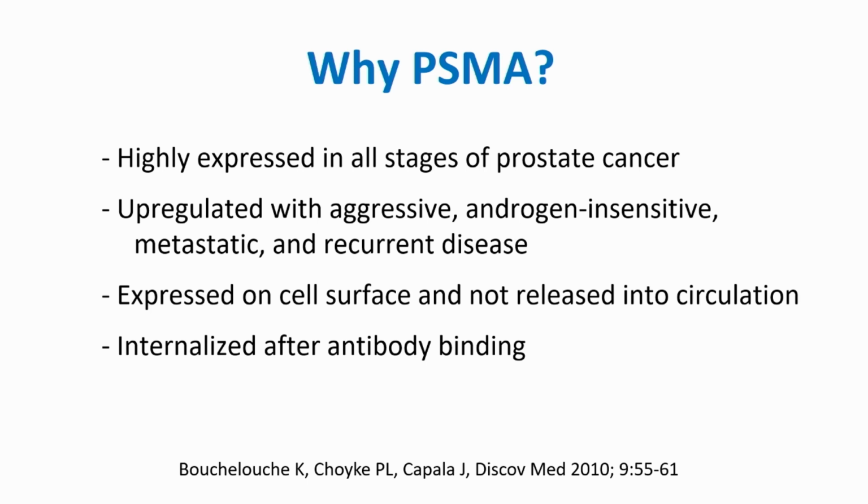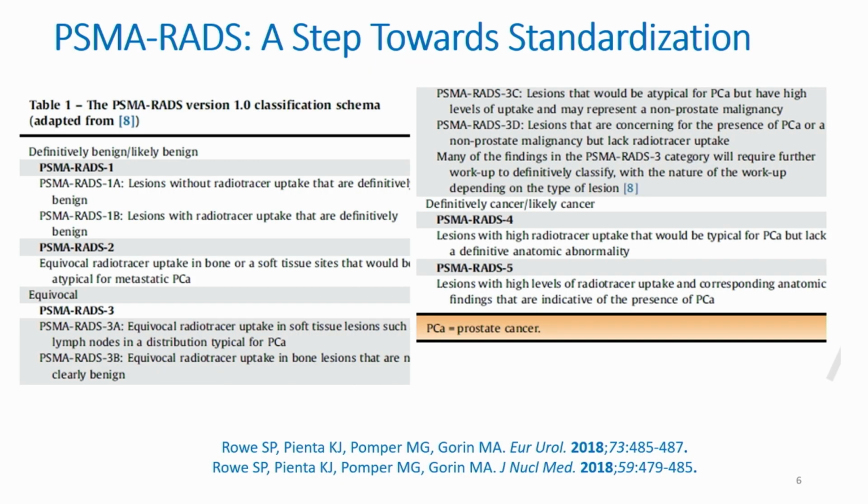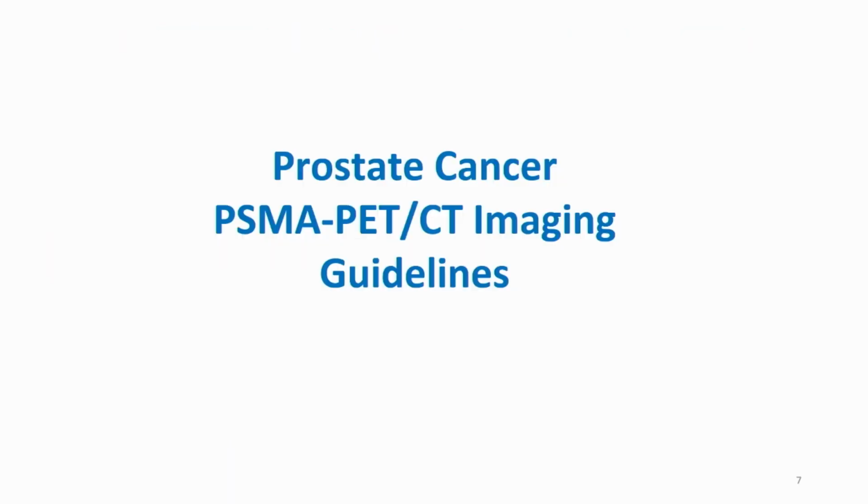So I'll skip this. We already heard why PSMA and what is PSMA. And then the important thing is this idea of standardization, and I don't think that we've done a good job yet of doing this, but various groups have proposed different standardization methods. A big one is the PSMA RAD score, which we discussed a little bit earlier. So just to go over the guidelines, both for localized as well as biochemical recurrence, the different bodies have different guidelines.